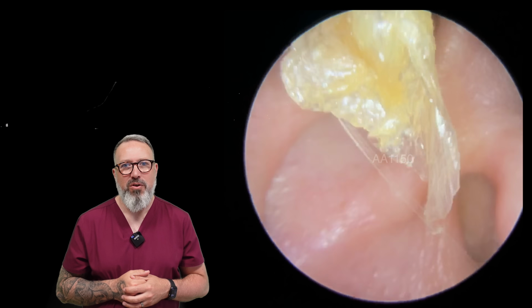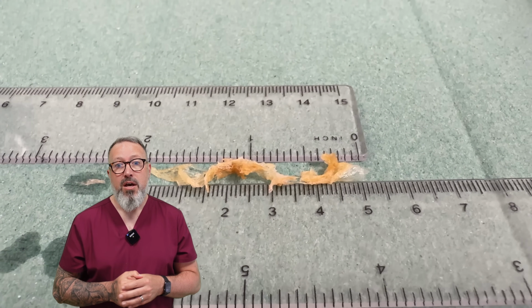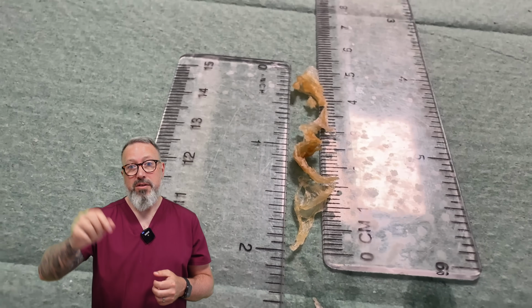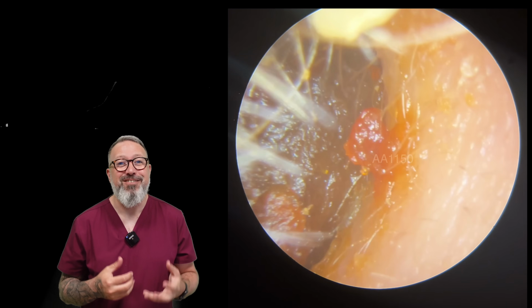But that skin came away really well towards the end. Looking lovely, really healthy looking eardrum there as well. So really, really good. So we've got 5 centimeters, 2 inches worth of skin. You can see that really long ribbon at the start there, just at the bottom of the screen. So yeah, really satisfying one to watch, and to do, to be honest.